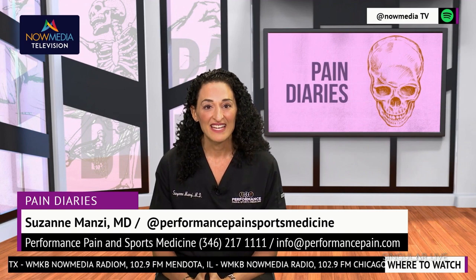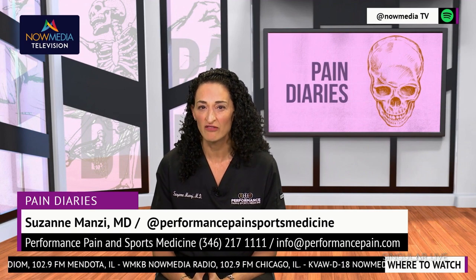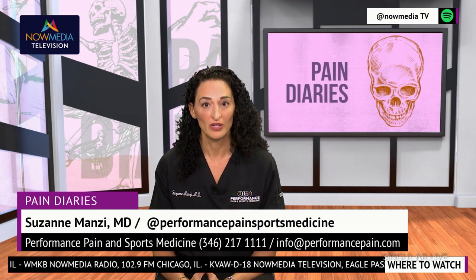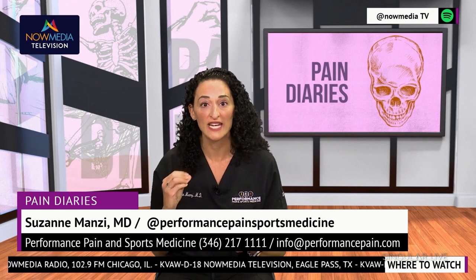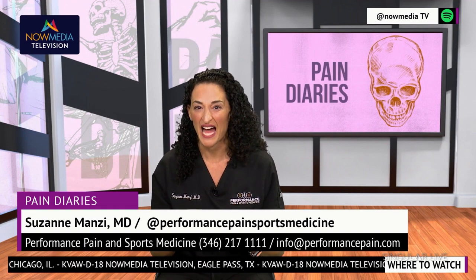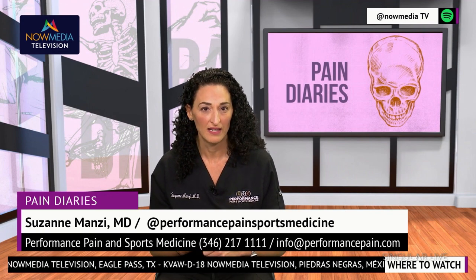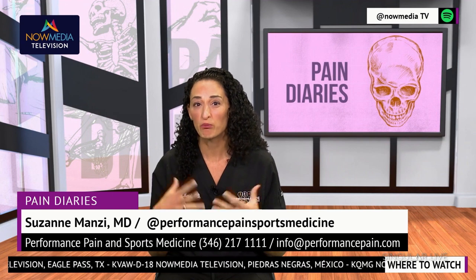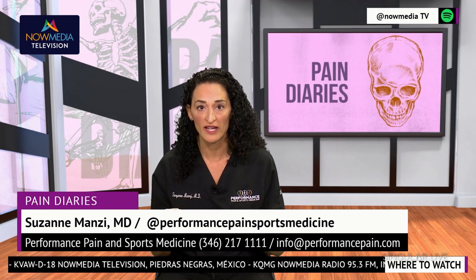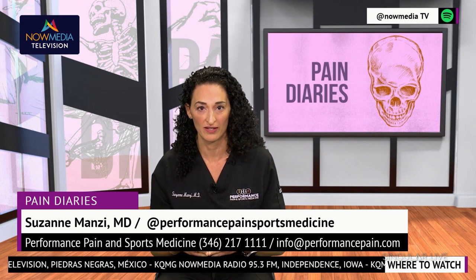The benefits of SCS are numerous. Unlike traditional pain treatments, SCS does not involve medication and has minimal side effects. It is also reversible, which means the device can actually be removed at any time if the patient no longer needs it. Moreover, spinal cord stimulation has a high success rate, with many patients reporting a significant reduction in pain levels, as well as improvement in the quality of life. Unfortunately, this is an underutilized treatment. Many primary care doctors do not even know about it or understand how it works.